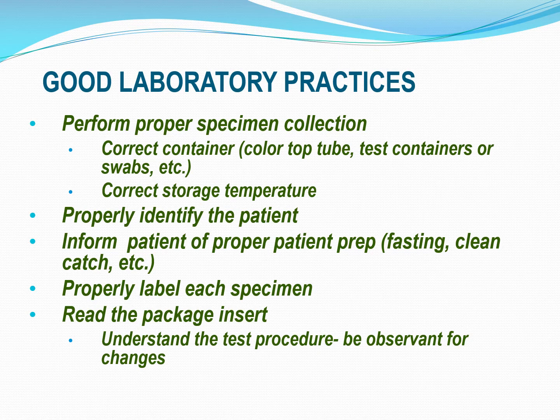So you want to make sure you collect the specimen, and a lot of kits have special tubes or containers that you collect the blood in, or special swabs. You want to make sure you use the correct thing, and you want to read that package insert. Is this something that once you've opened it, it now goes in the refrigerator, or do you keep it at room temperature, or does part of the kit get stored in the refrigerator and the other part at room temperature? Read over your package insert each time you open up a new kit and make sure you become familiar with not only how to use it and what collection method needs to be used, but also how it is to be stored.